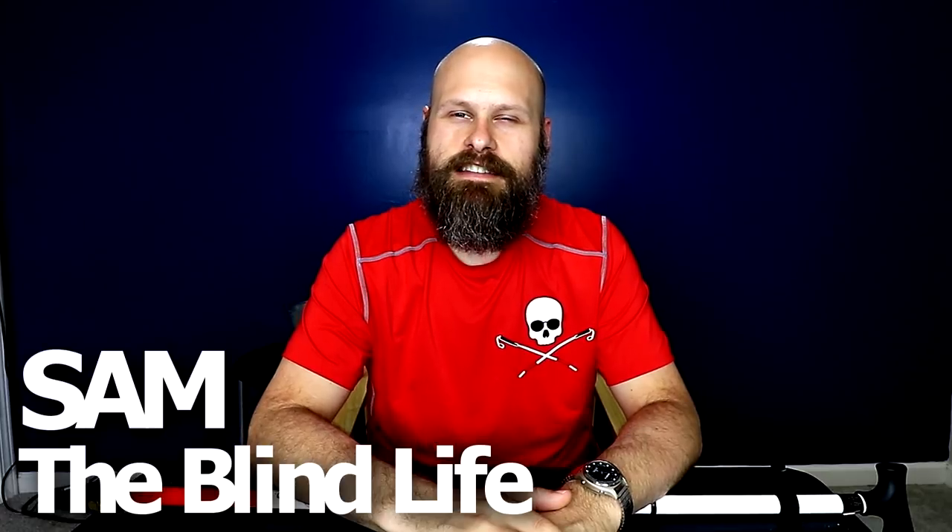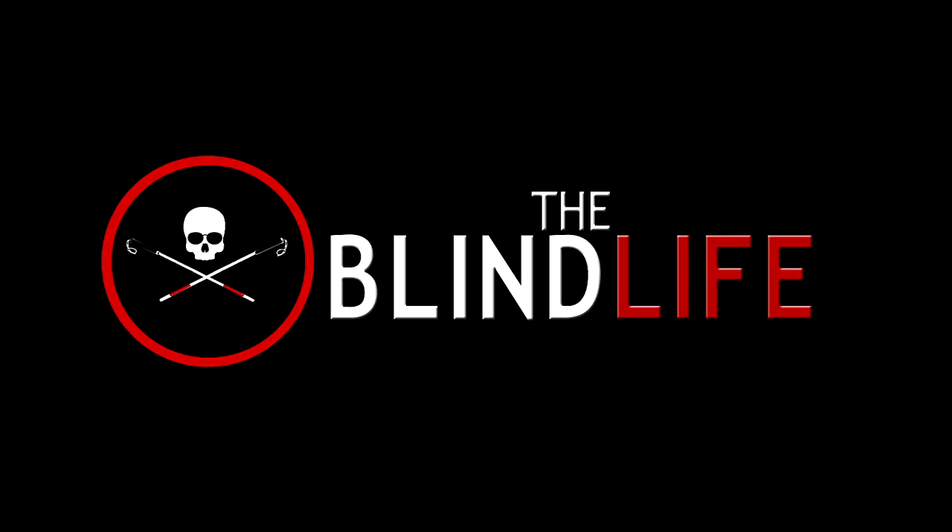Hey guys, it's Sam with The Blind Life and today we're talking about canes. I recently got a question about how I particularly use my cane, and I thought this would be a great opportunity to talk about that, as well as canes in general and some interesting things I know about canes — but mainly answering that question of how I use my cane.